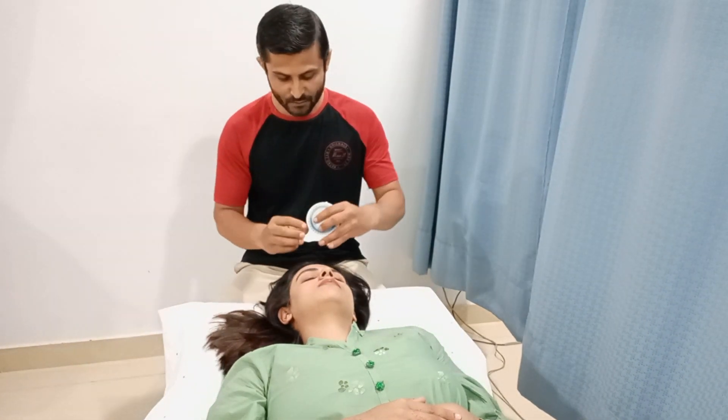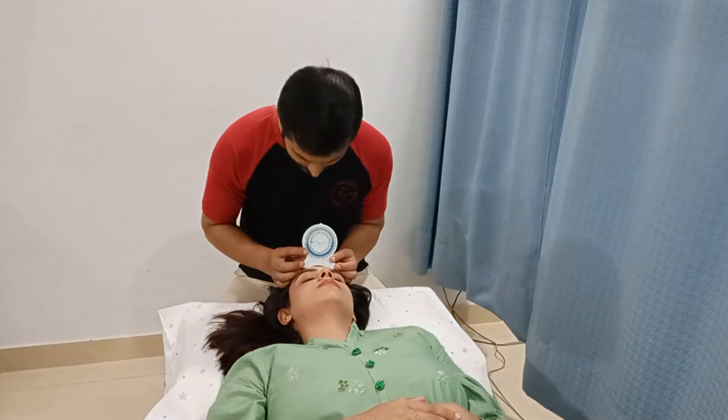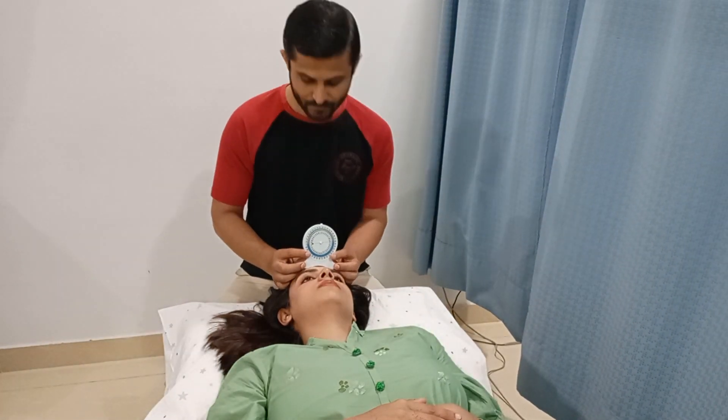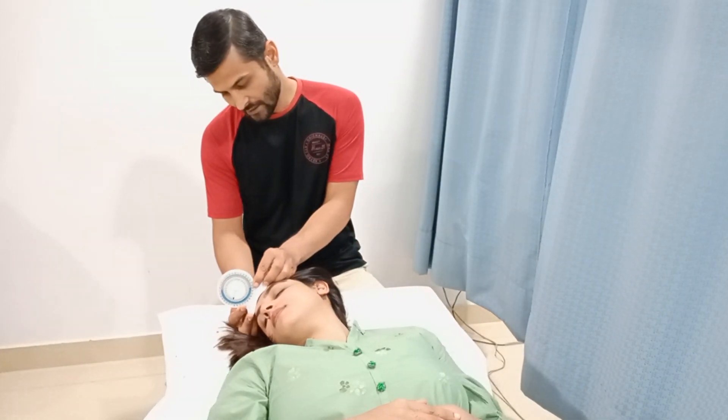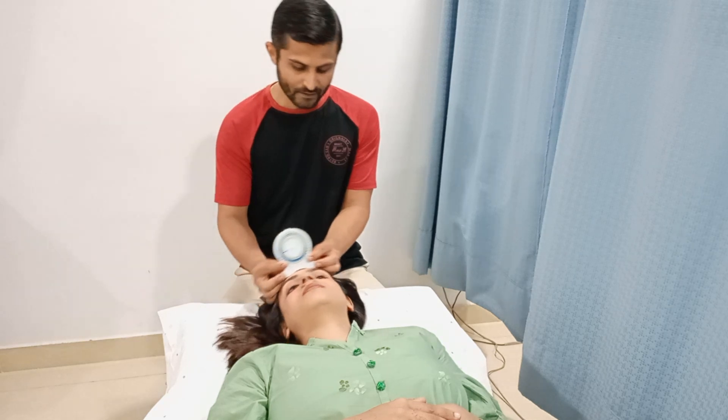Let me show you from the front view. This is the neutral position, then to the right side, and then to the left side.